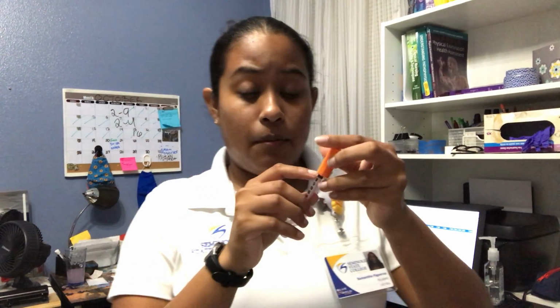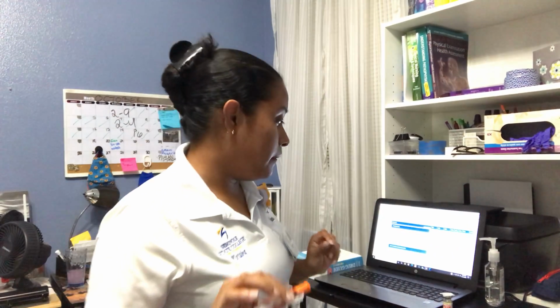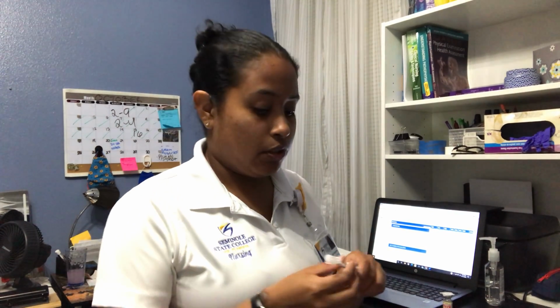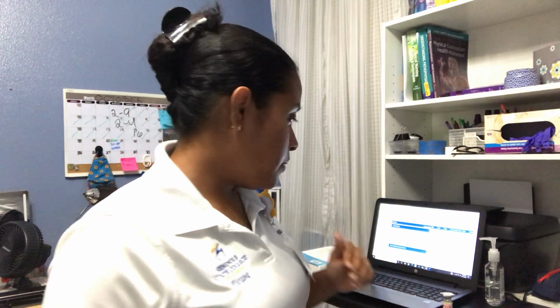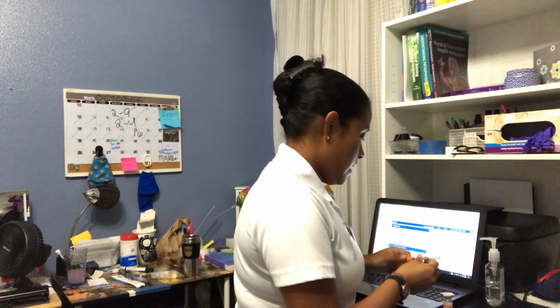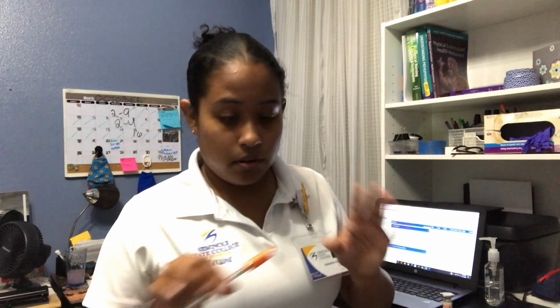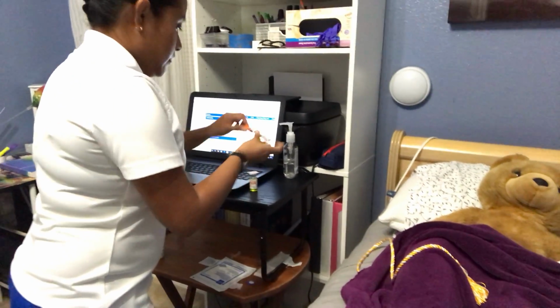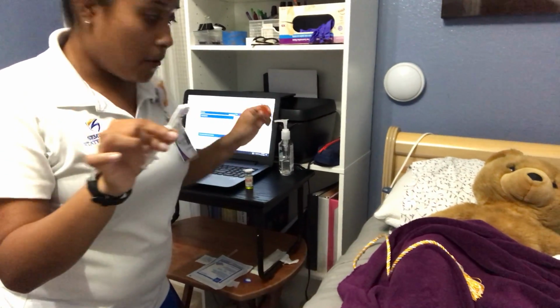Alright, now I fill up 4 air and then I'm going to go rainbow and insert it into the vial, and I'm going to put in air, making sure that no air touches the liquid. Okay, and I'm going to be very careful so I don't injure myself. Alright, so I'm going to push the camera here. I'm going to do the rainbow.